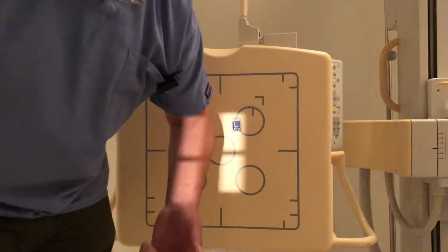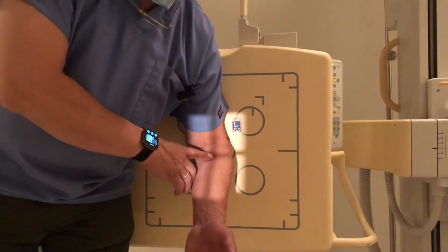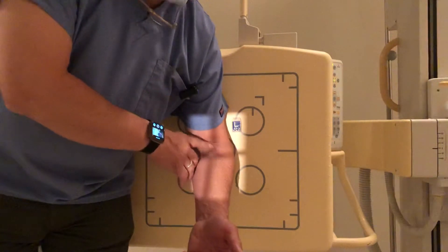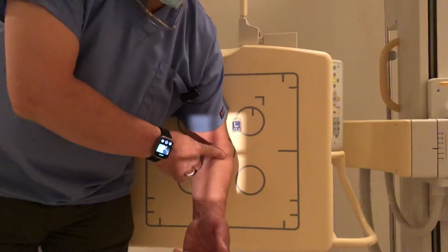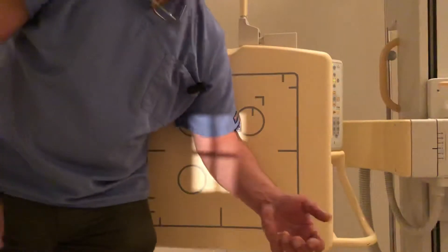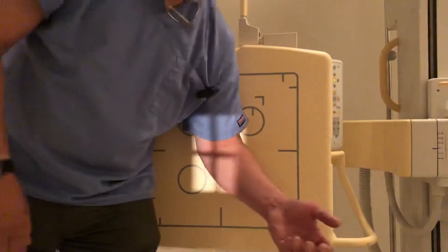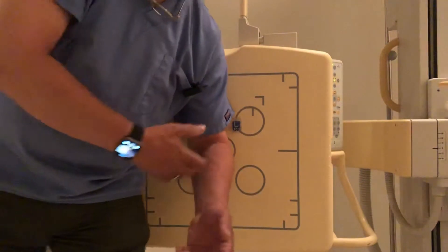That's the shadow that you need to see going straight up and down the forearm because if it is going down the middle, then you know that your forearm is 90 degrees to the plate, and if it's 90 degrees to the plate, then your epicondyles are going to be parallel to the plate and that's what you're trying to get parallel here in this proximal or distal humerus position.